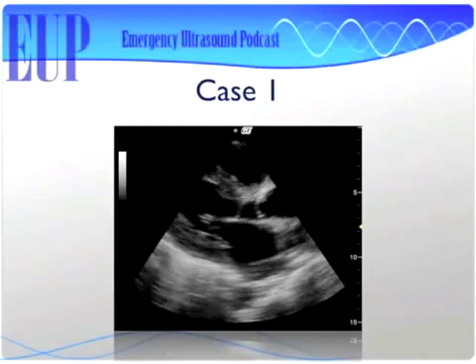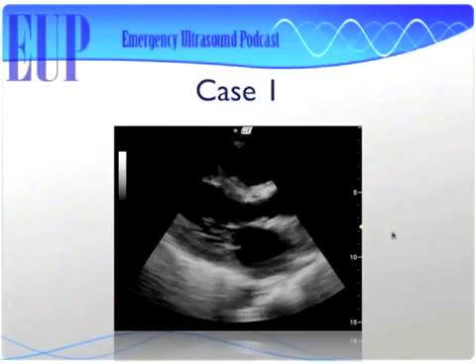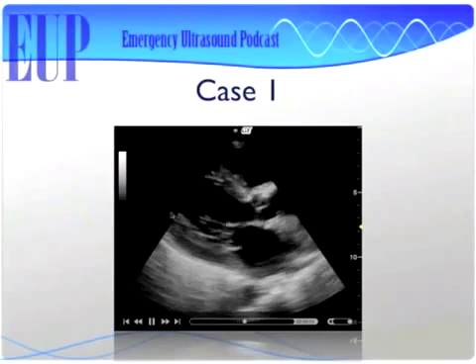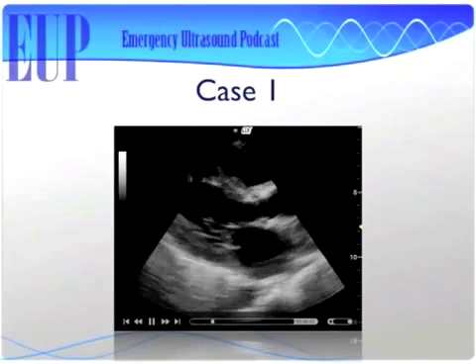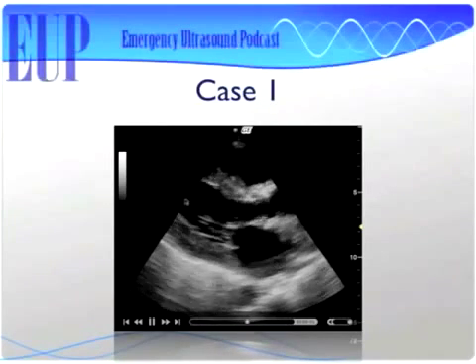I see right ventricle, then left ventricle. I see a left ventricle that is not squeezing all that well. So Matt's talking about this area right in here, and you're saying you don't feel like this left ventricle here is squeezing very well. No, I see poor function. Why would you tell me that you see poor function?